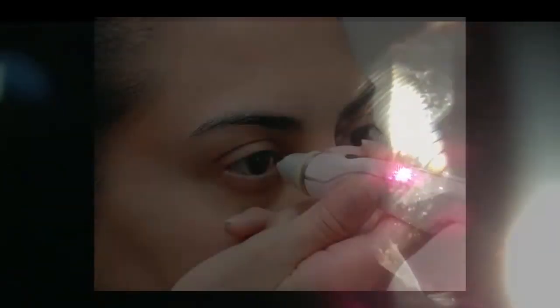We may or may not put a lens on your eye during the procedure, depending on the view, though usually I do a no-touch technique. You will hear clicks as the laser fires, and it may take several dozen to several hundred shots to fully open the capsule. This is because some capsules are much thicker than others.